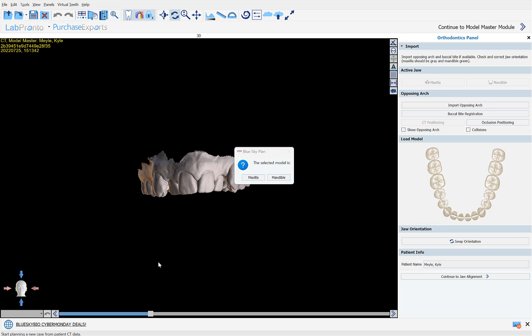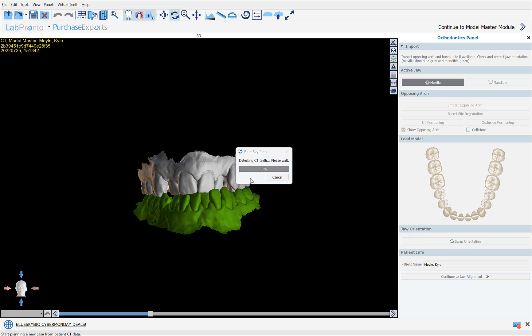The software confirms the relevant jaw for the model. Click on the relevant option and the software will proceed to automatically detect and segment the teeth from the CT scan.